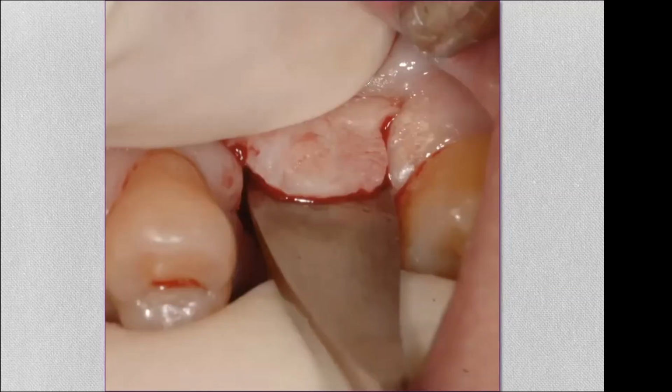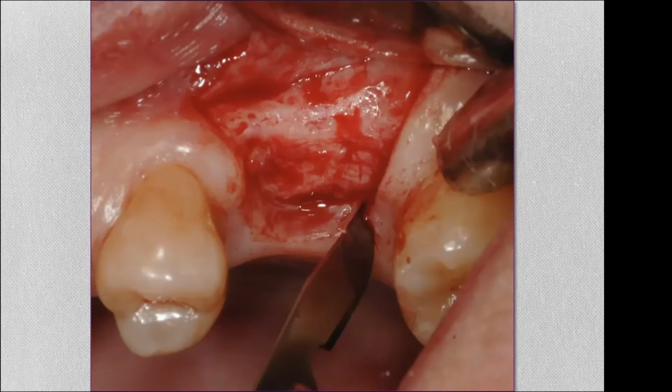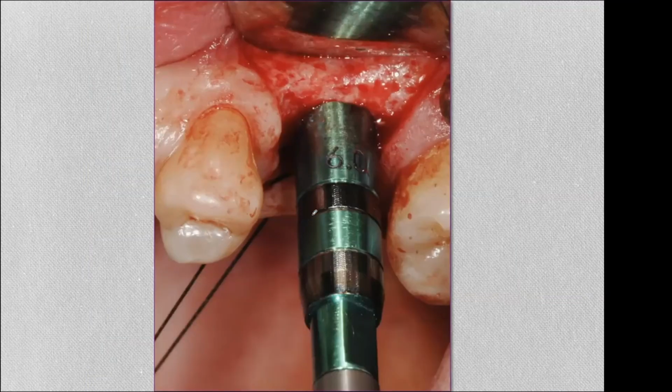You don't need to over dissect the flap, so keep a finger as you're lifting the flap so you don't rip it, and protect it. I use a retraction suture. It may seem to you a waste of time, but it just makes the procedure so much smoother. And certainly if you're taking pictures, it's invaluable. And then I made a couple of little back cuts so that I can be sure I see the edge of the palatal slope. And this is from the Bicon kit, a 6 millimeter sinus floor osteotome.